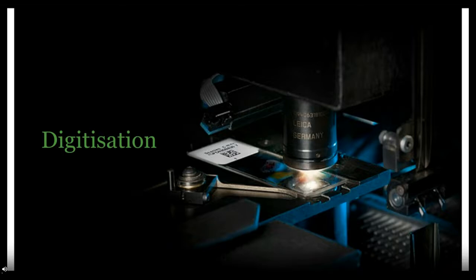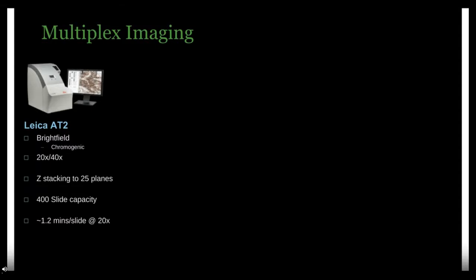Once we've stained the slides, then generally our slides get digitized. The multiplex slides particularly need to be digitized to be interpreted. But we have a Leica bright field scanner, which we use primarily for digitizing bright field slides for collaboration purposes, for sharing with collaborators at different sites across the country and around the world. But it's also used to digitize chromogenic stains that our researchers want to perform image analysis on.